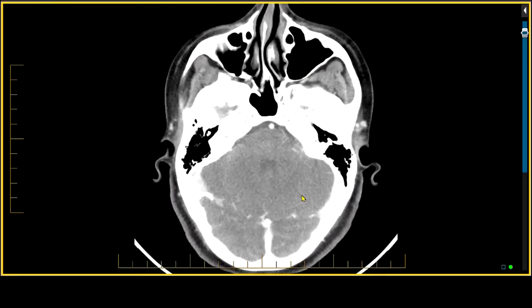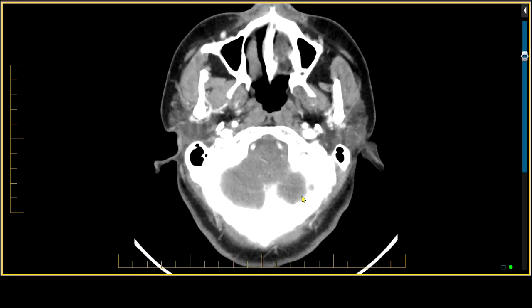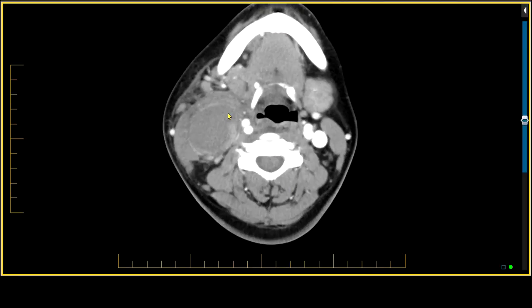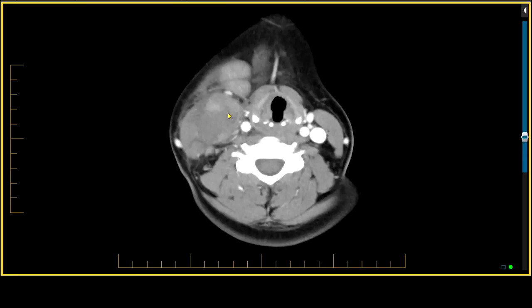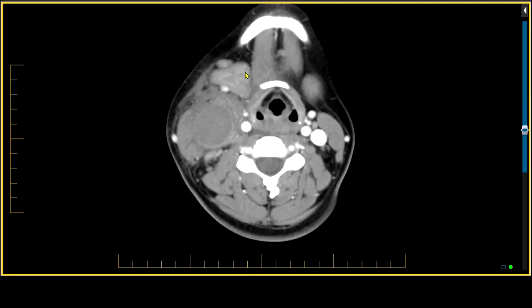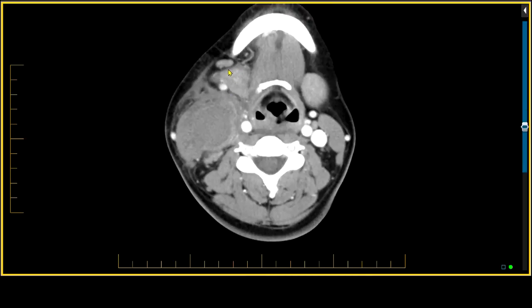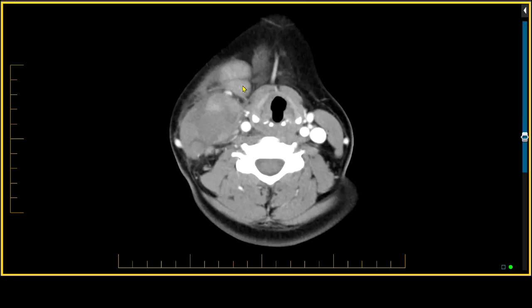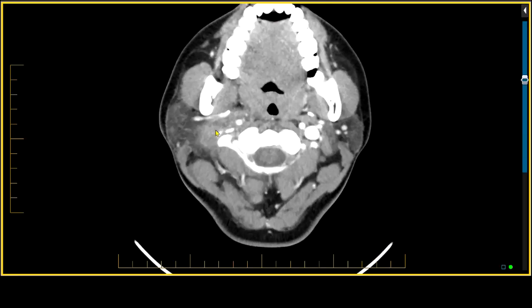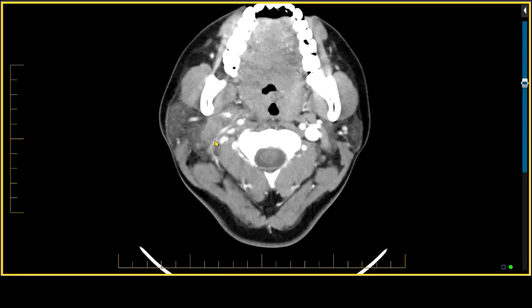This is a case of a patient who presented with a submandibular region mass. Looking at the CT scan through the head and neck region, we see a very large mass appearing to extend below the level of the mandible, hence it was felt to be a submandibular mass. What you see here is the submandibular gland — this was not a mass within the submandibular gland, but a mass posterior to it that extends all the way up into the parotid gland.